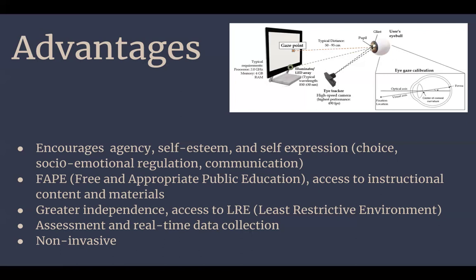And assessment can be done by the individual using their eye gaze device rather than having a support worker fill out answers to questions. And an eye gaze device is also potentially non-invasive. There's no need for bodily contact or hand over hand, as a student can maintain their dignity and privacy while interacting with materials and working on assignments, exams, and assessments.